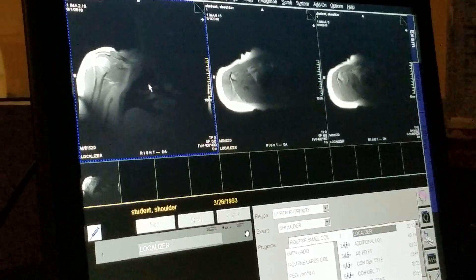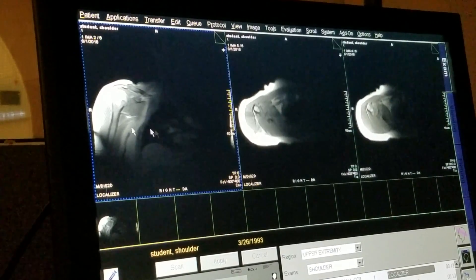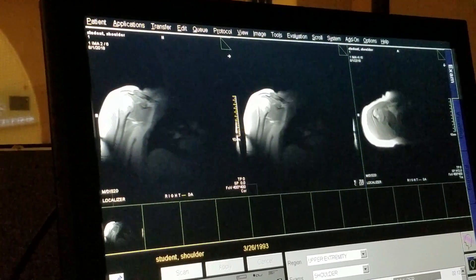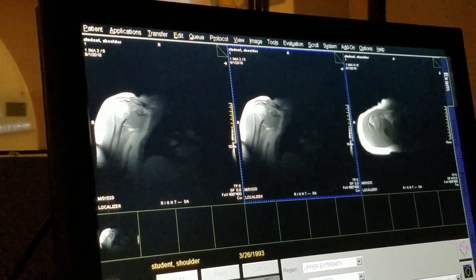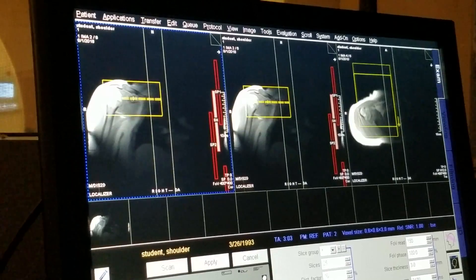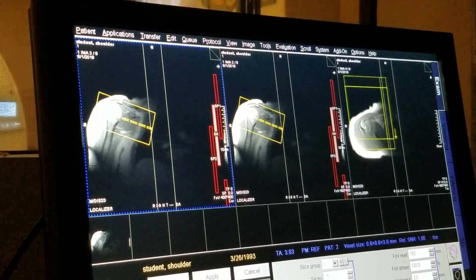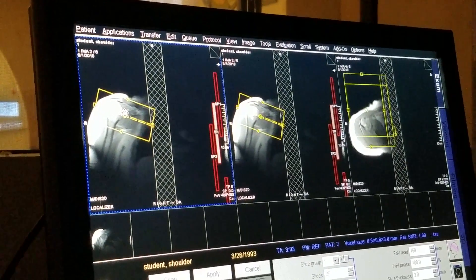Right now, here's the localizers that the scanner gave us. Wonderful, great — it's a great starting point. Here we have a coronal imaging plane, a couple of axials, a couple of coronals. One of my biggest pet peeves is when I see someone bring an axial over after seeing this, like 'oh we can see the coronals, so let me just position.' And either they'll position like this, or they'll think they're doing great and just start positioning like this. But truly you have no idea what angle axially and sagittally you're scanning at right now.